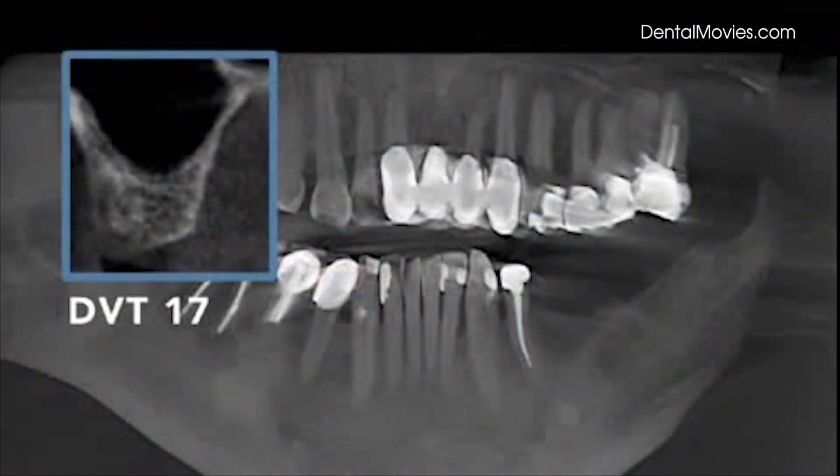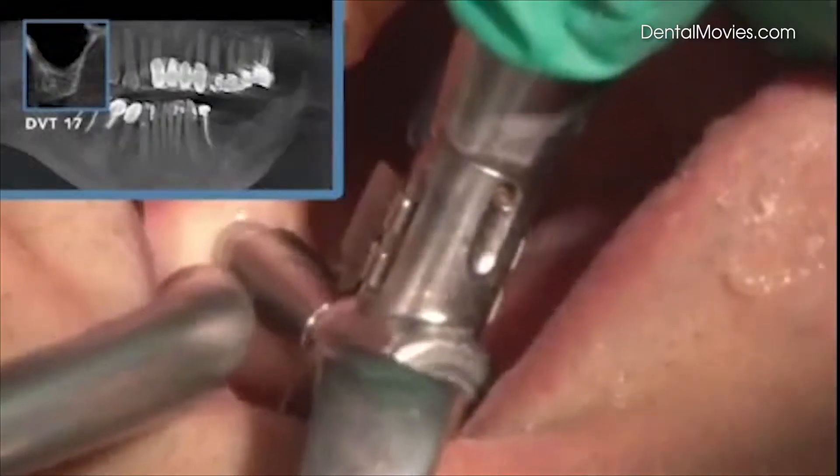The sinus lift is done at position 1-7. This will be a bridge 5, 6 half, 7, with a remaining bone height of 6 mm.